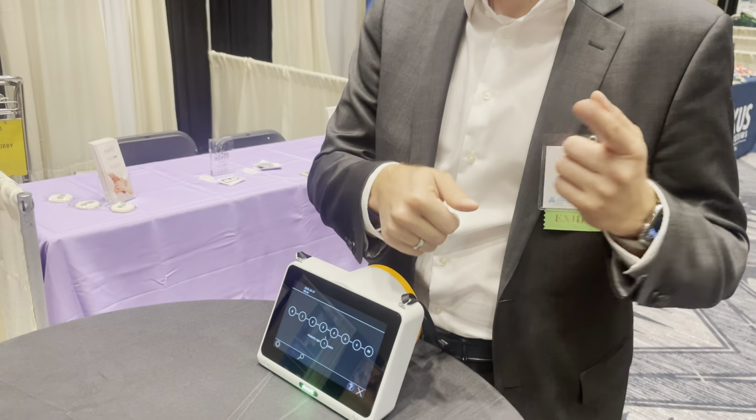Super important that you have this picture, because in a red reflex test, like I explained in the beginning, they have no proof of what they did. And they have to be like, did I see that? Did I not see it? Okay, I think I didn't see it. This way, you can document it. And if someone says, hey, you missed something, doc, you'll be like, hey, here's my test, this is what I did, look at it yourself.